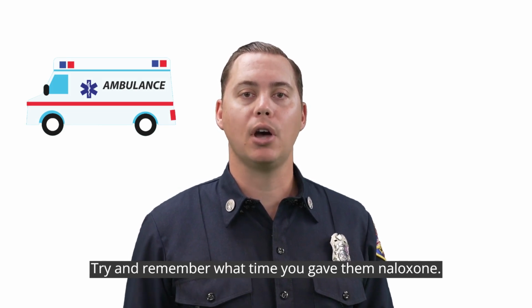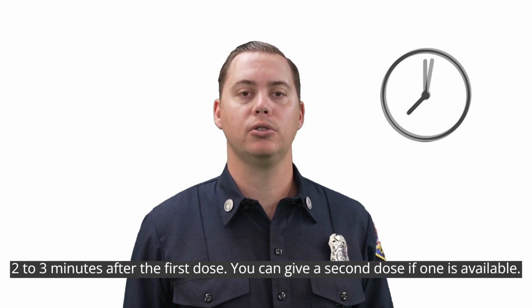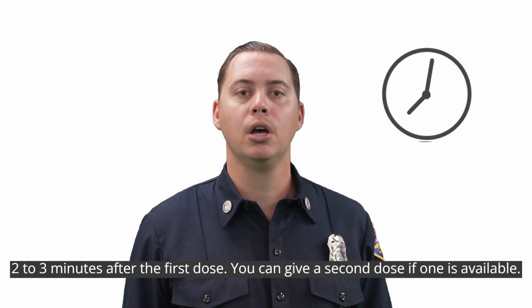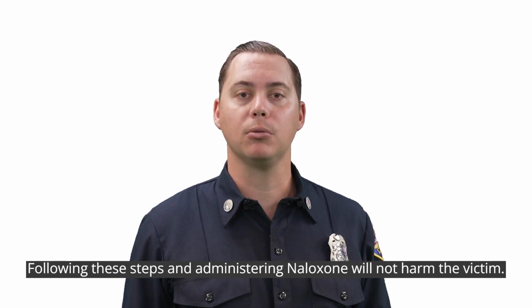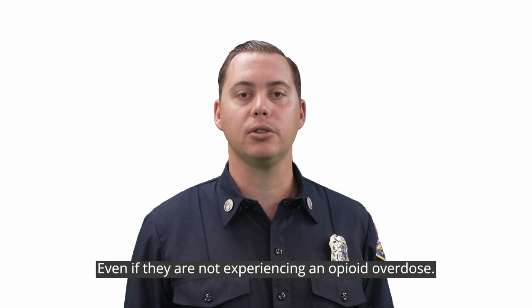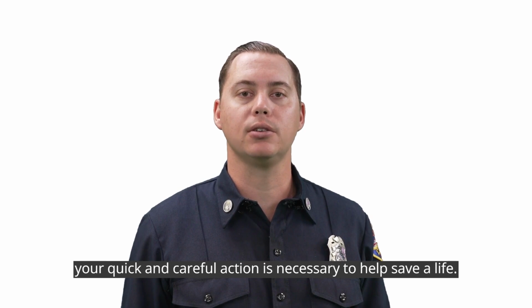Try and remember what time you gave them naloxone. If there was no response or minimal response 2 to 3 minutes after the first dose, you can give a second dose if one is available. Following these steps and administering naloxone will not harm the victim even if they are not experiencing an opioid overdose. Your quick and careful action is necessary to help save a life.